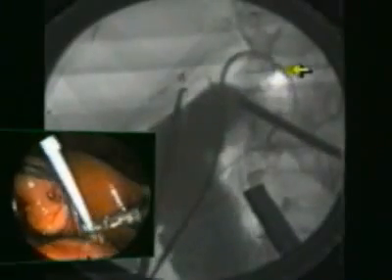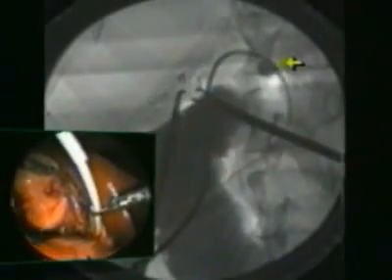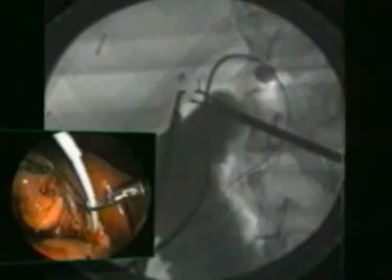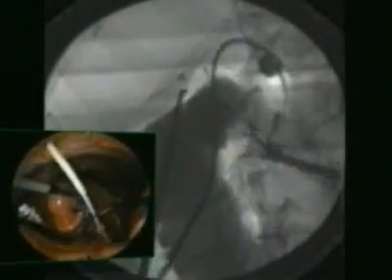Next, with the aid of the guide wire, a Fogarty catheter inflated with contrast medium is introduced, passing from the cystic duct to the duodenum to confirm the optimal sphincter dilatation as it pushes the calculi into the duodenum.